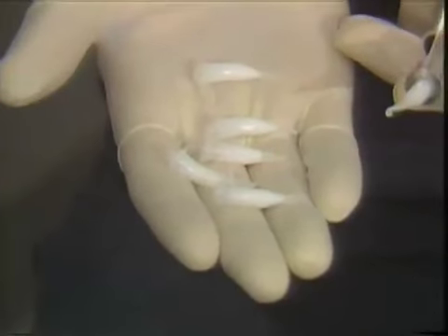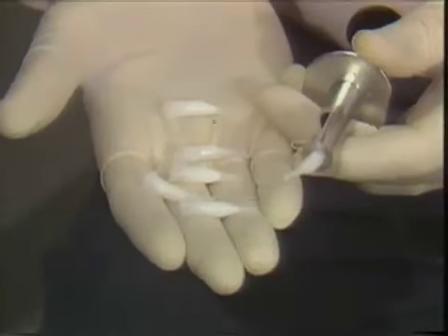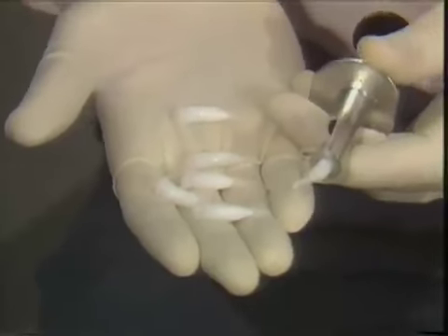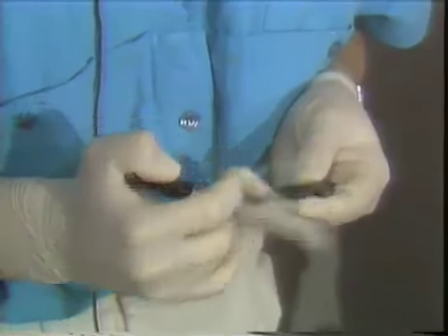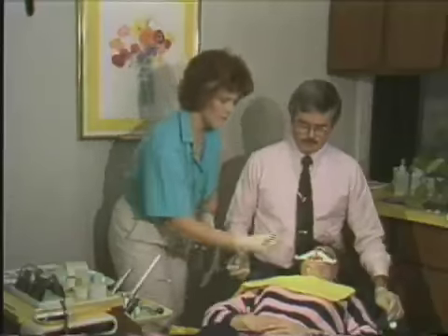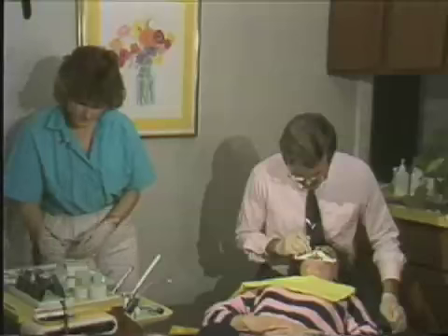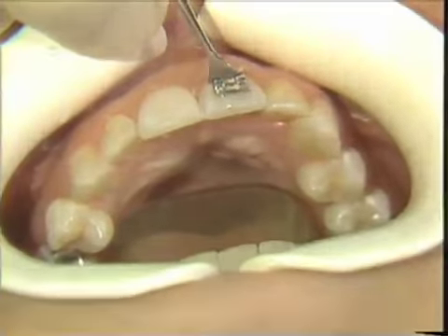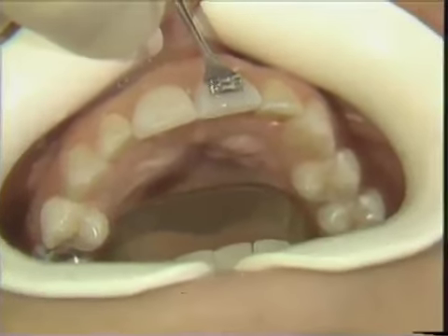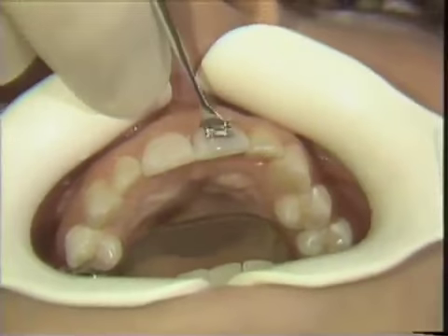The Reliance comes in preloaded tips, and so they can be placed in the syringe for easy application to the bracket. Usually the application of the adhesive is carried out by the chairside person. Liz is now placing the adhesive in a thin layer on the bracket, and then she will place the bracket on the tooth. I now have about 30 seconds to position the bracket. This again is done with the gold foil knife. Then I check the position, and then I press it to place.